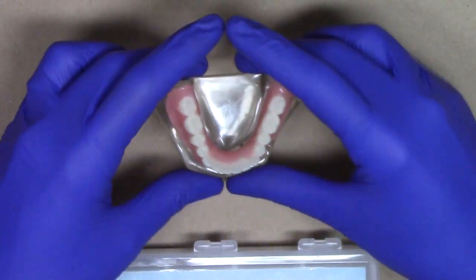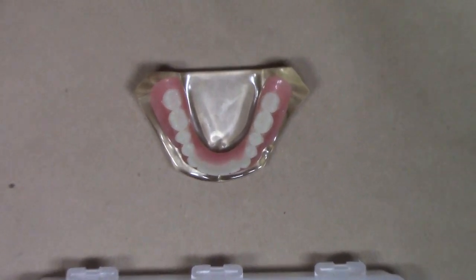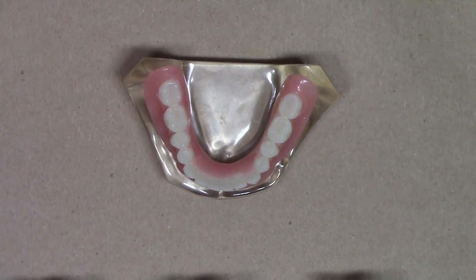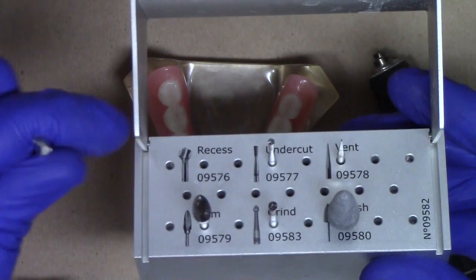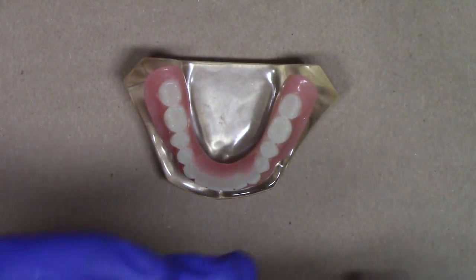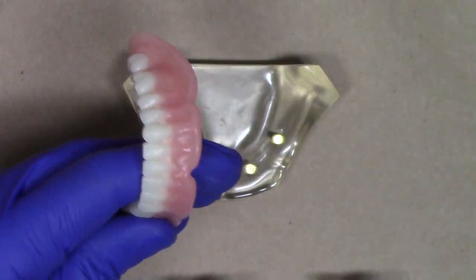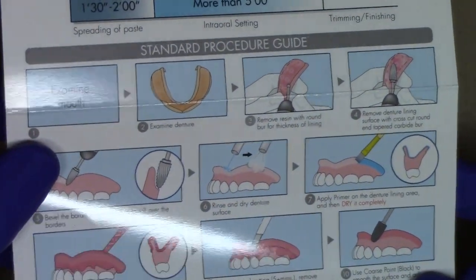So now what I need to do is prepare my denture for working with the CHAIRSIDE Soft Reliner. I zoomed in a little bit so that you can see this preparation step a lot better. What I like to do is take out from my prep and polish kit the trim burr. I'm going to use my trim burr to prep the outside part of my complete denture. And if you're following along, that's right here on this step.